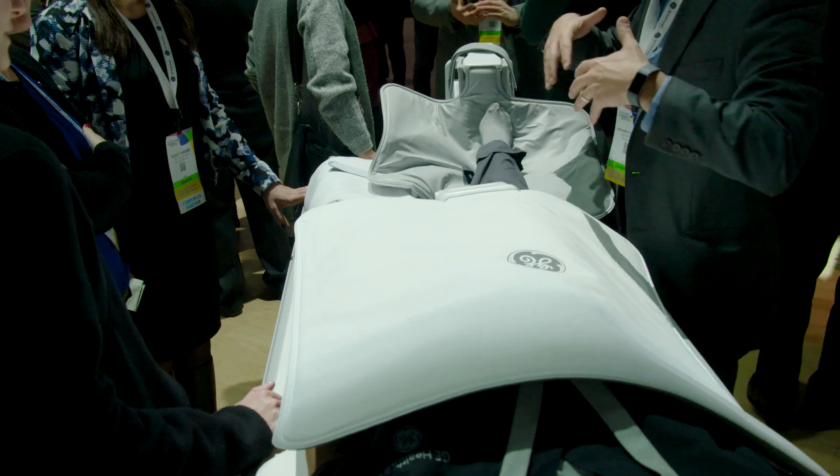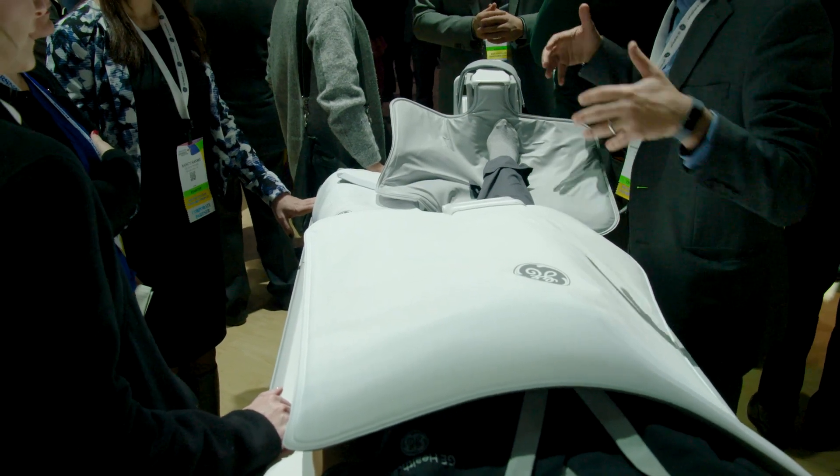Not only do we have our anterior array coil, but we've now introduced two multi-purpose coils — both medium and large — to accommodate more patients. The more comfortable a patient is, the better image quality we get, because they're able to hold still and get through the entire exam.